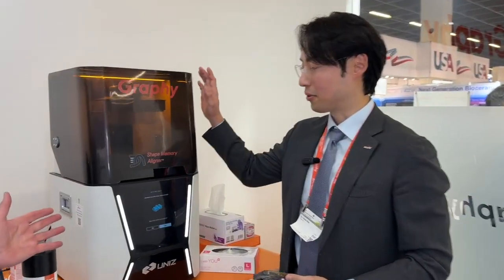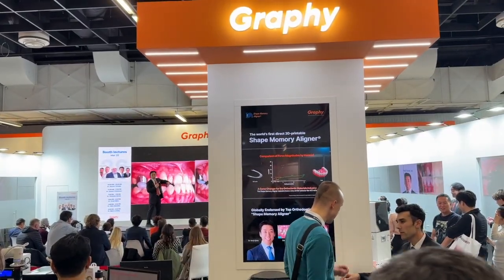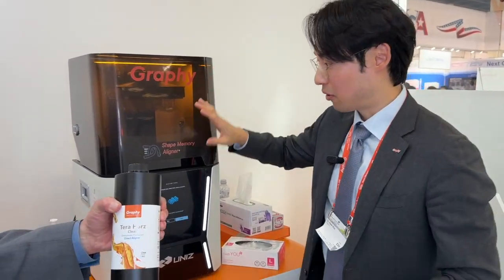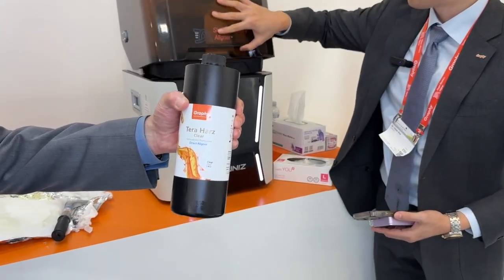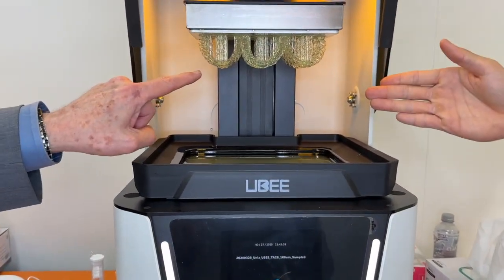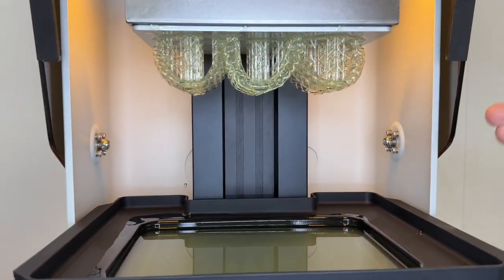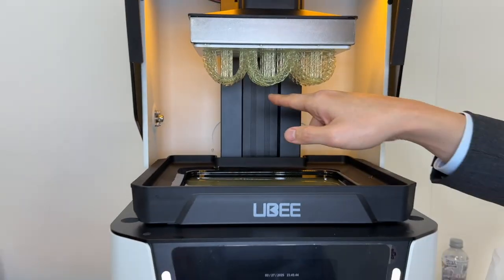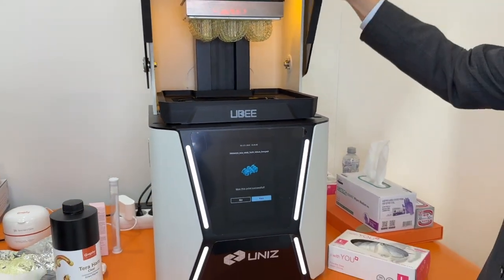So how do you do the 3D printing? Our company synthesized and designed ourselves a special resin for direct print aligners with shape memory. We just print it from the resin within 30 minutes. Then after removing unreacted material, we can easily remove it without any solvent.